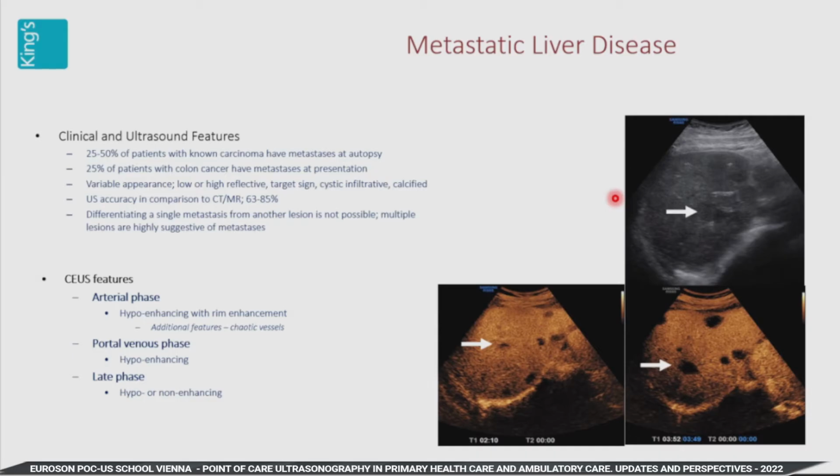That contrast will become black within 30-40 seconds. It's very rapid and very clear. And it's a clear diagnosis to make, and you can then triage the patient appropriately for further management. So it's a very useful thing as well.